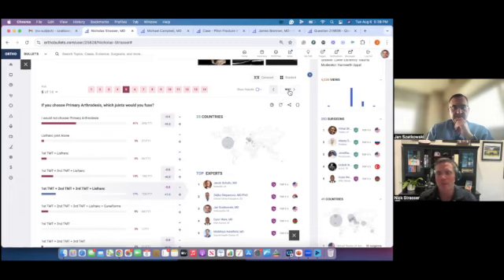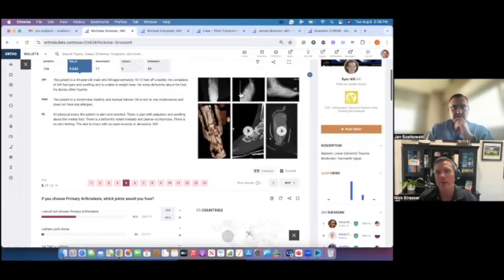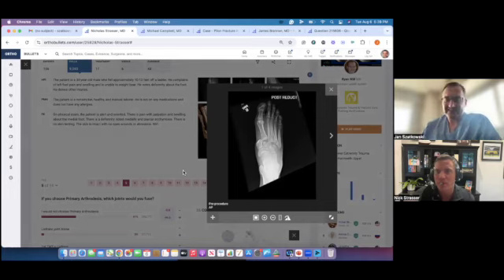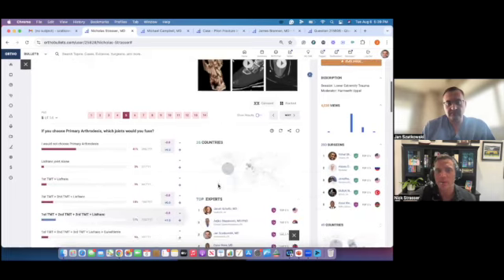I felt like I needed to include all three because you look at the fourth and fifth; they're dislocated as well, and I think my stability to those joints is contingent on having good fixation and alignment on the first, second, and third joints. And I think our brothers and sisters in the UK have shown that maybe pins are not necessarily necessary in the fourth and fifth, though we tend to use those. But I think that's kind of a next level question: okay, so you fixed first, second, and third. What do you do with the fourth and fifth?